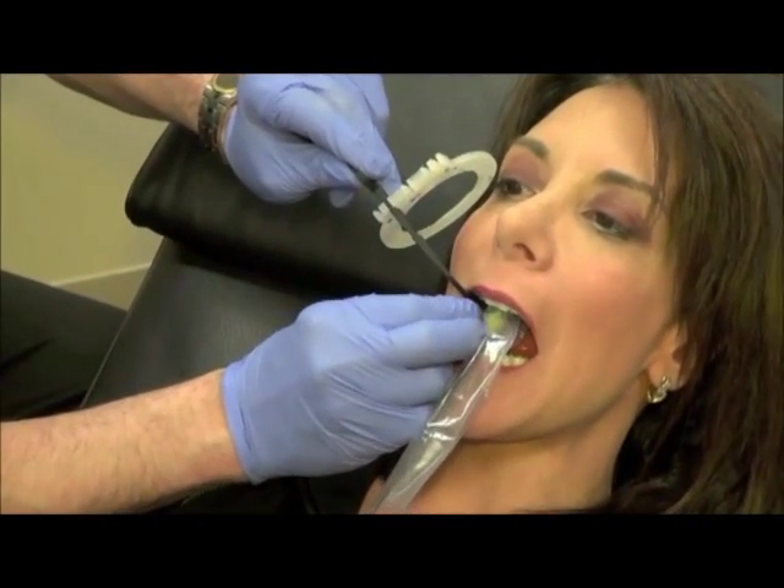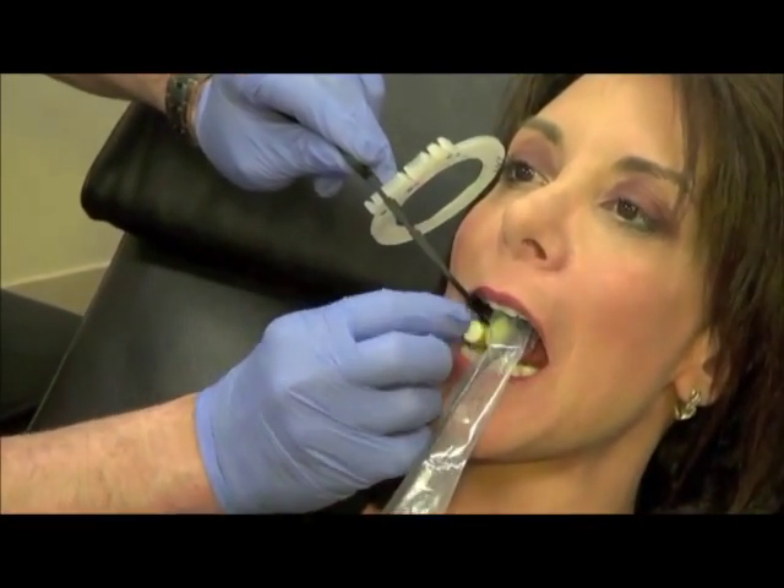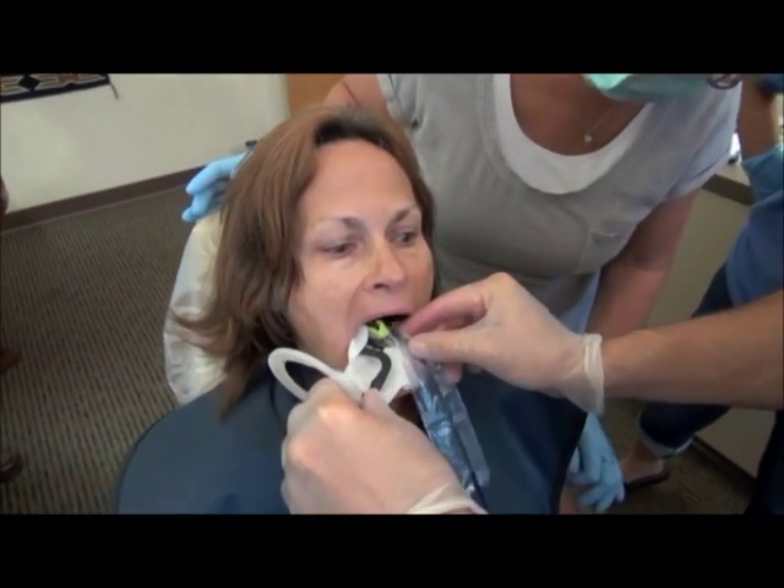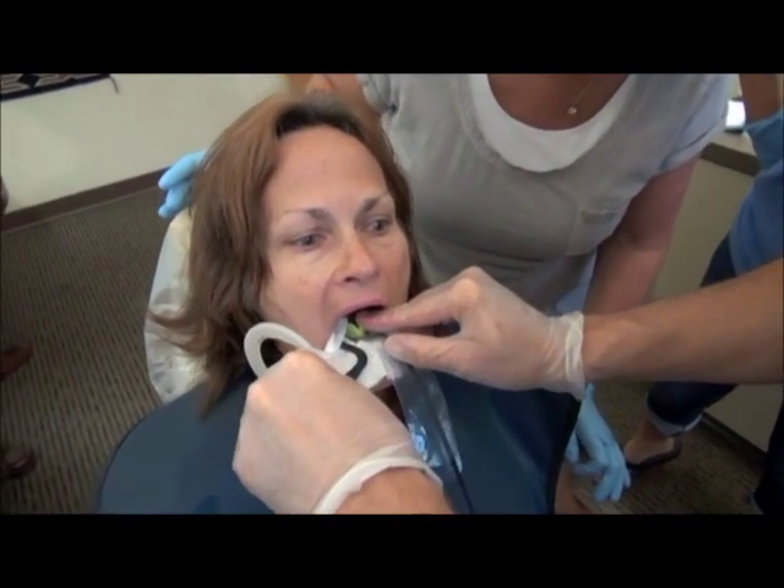In this video we're going to show you some additional tips like using a cotton roll for upper posterior PAs, or any PA for that matter, to stabilize the holder and to add to patient comfort, as well as using a 2x2 to cushion tori or other areas where it may cause discomfort if the sensor contacts that area.